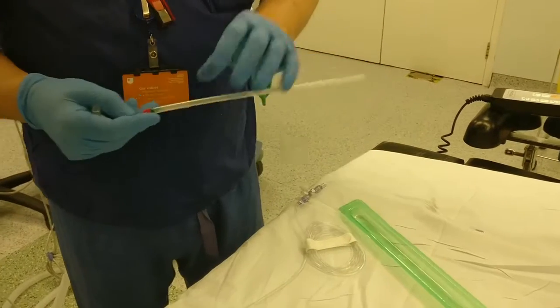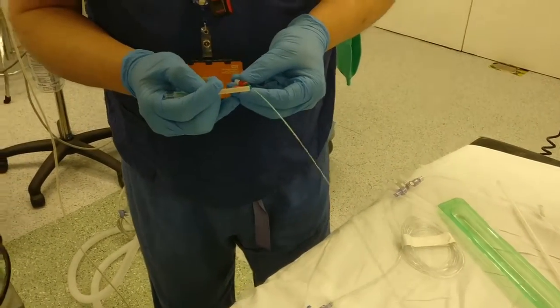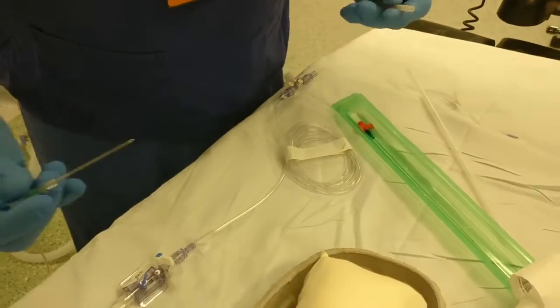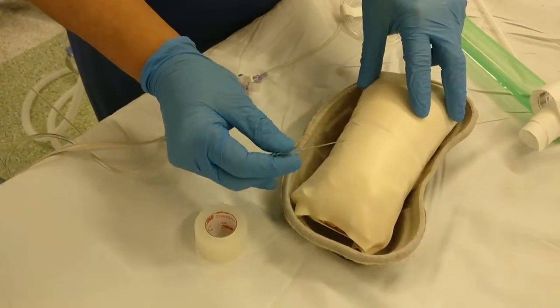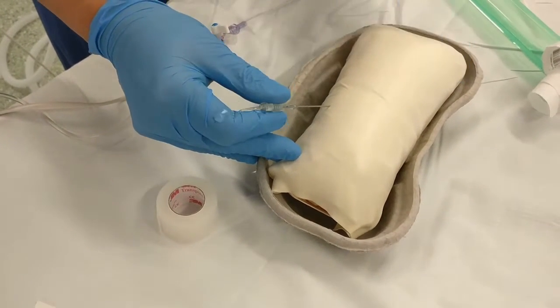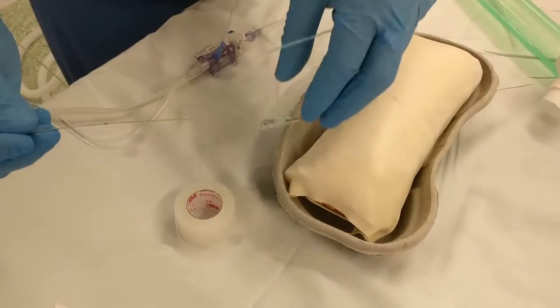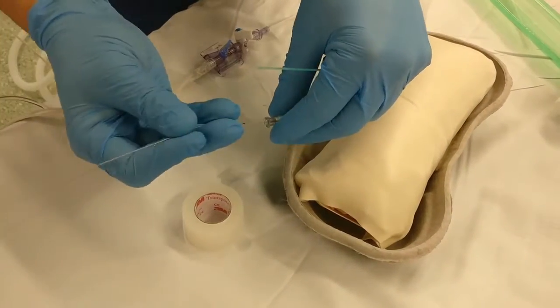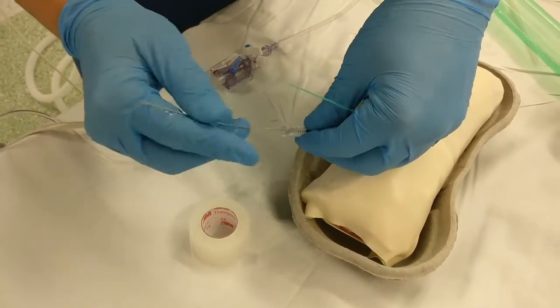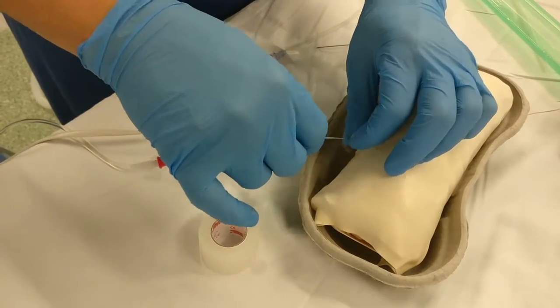At this stage, either a Venflon or an arterial cannula, as shown here, can be used to measure the compartment pressure. The needle and tubing should initially be primed with saline, and the needle inserted perpendicular to the skin in the area of interest and directly into the compartment. If a Seldinger technique is used as shown here, only a short passage of the wire is required. If a Venflon is used, the needle and cannula is passed through the skin before the needle is removed.